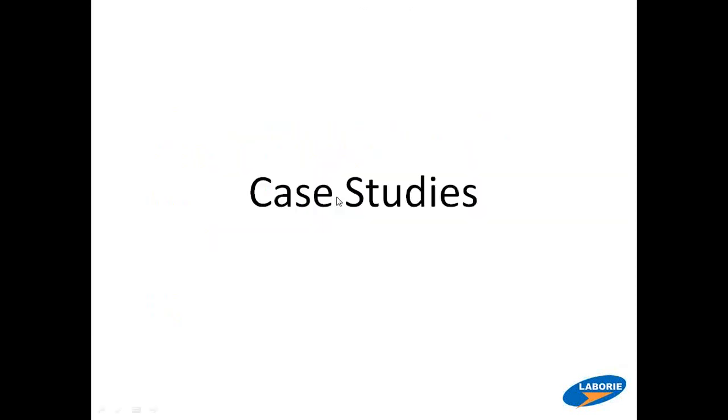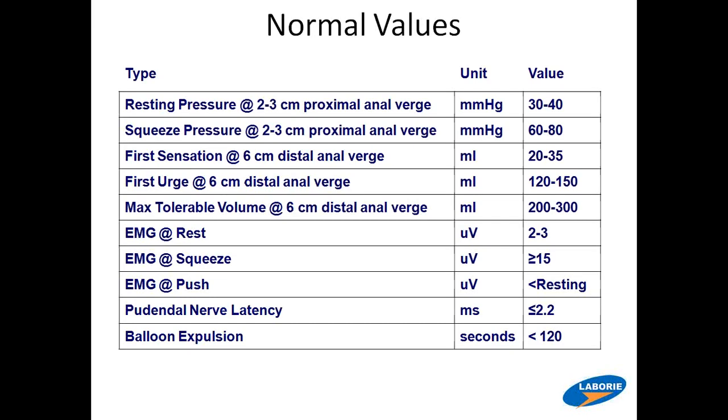Okay. And this might be a good time, Kim, to see if there's any questions and be sure that people are following me before we go into the case studies. There was one question that came in while you were speaking. This was a few slides ago, but the question was, what if they have an afternoon appointment and they are diabetic? Should they still not eat?